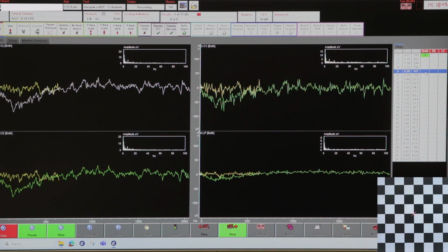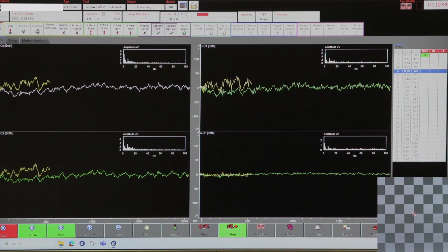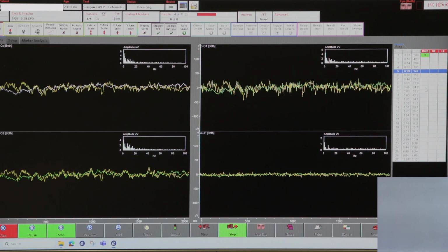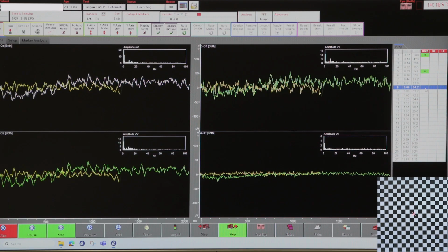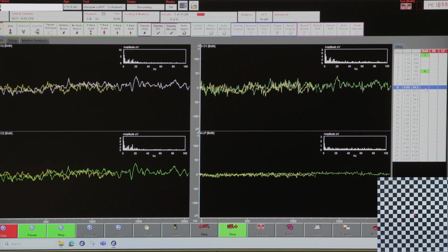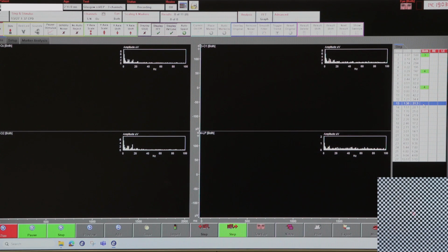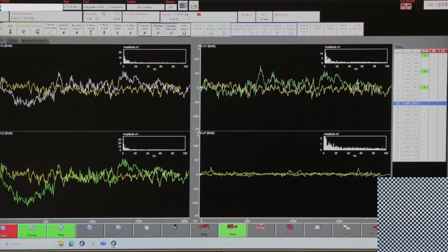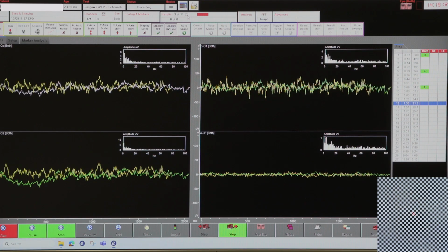Let's watch another example. A few things to notice here. The process always begins with large checks because we designed the system to maximise the amount of time a child was looking at a stimulus which they could see. Notice also the low noise level on the Laplacian channel. Those close reference electrodes are very effective at cancelling noise, but preserve a lot of the signal. So often the Laplacian has better signal-to-noise ratio than the real channels.